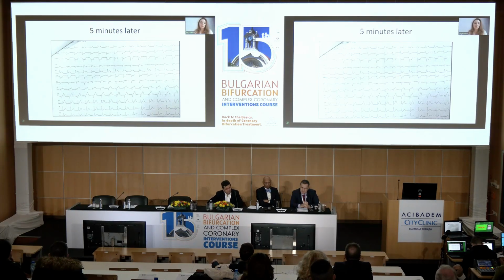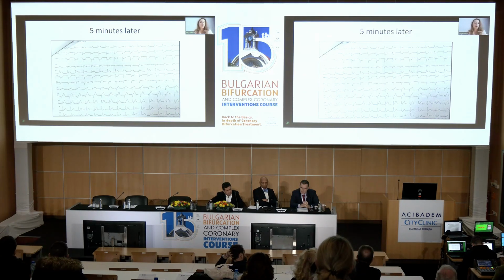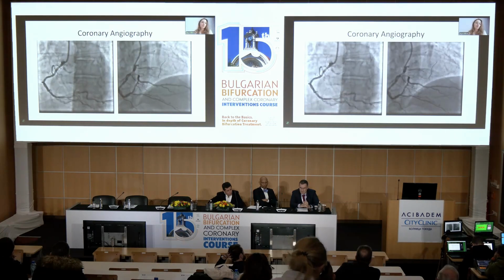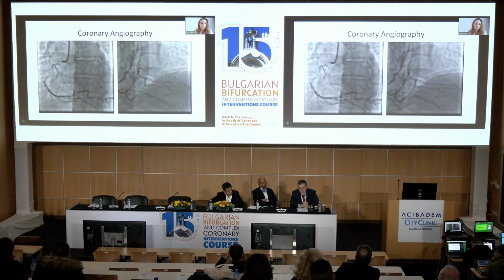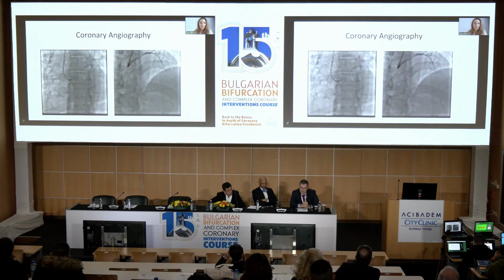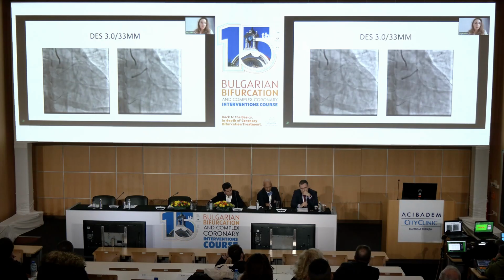And here you can imagine that the invasive cardiologist had the opportunity to know beforehand that this patient has abnormal coronary arteries, that everything is originating from the right, so he could focus directly there, even though the lesions were from the anterior wall. So you see, this is what we found: a severe lesion in this long left main that has a retro-aortic course. And the patient was stented.